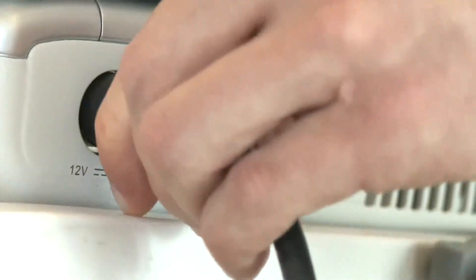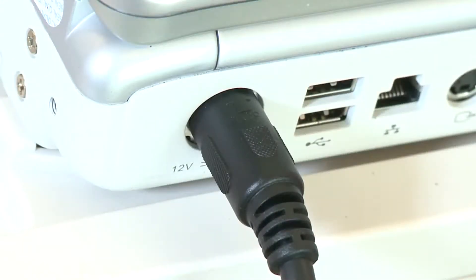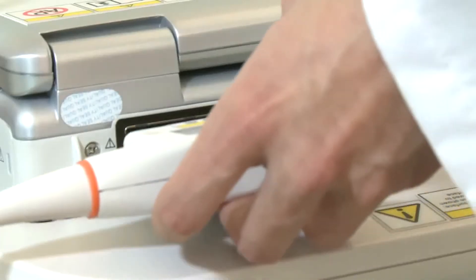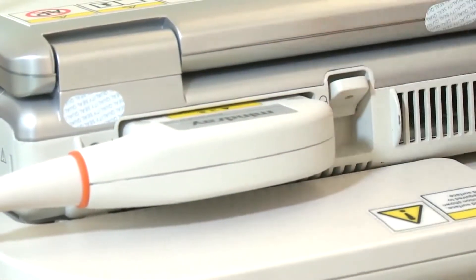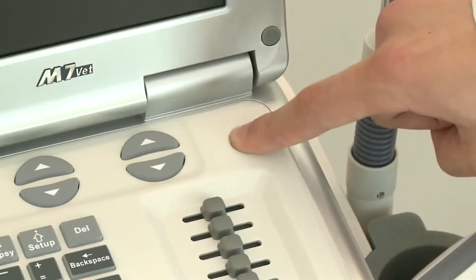Connect the power cable. Plug the probe into the connector and lock. Power on the system.